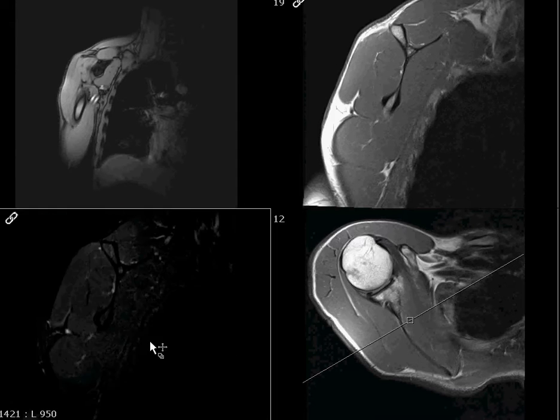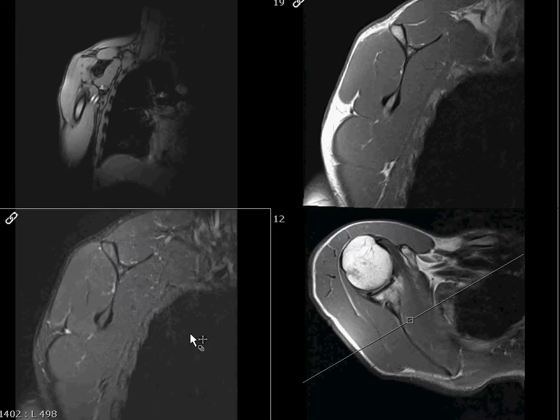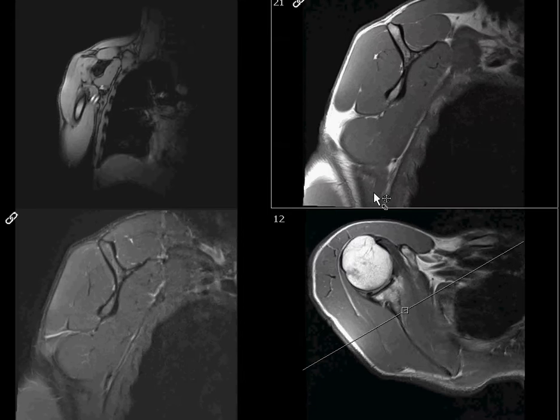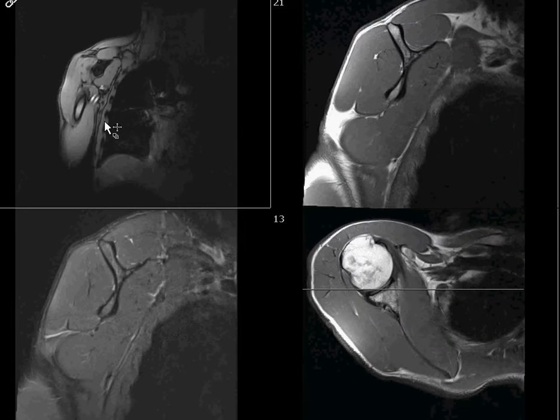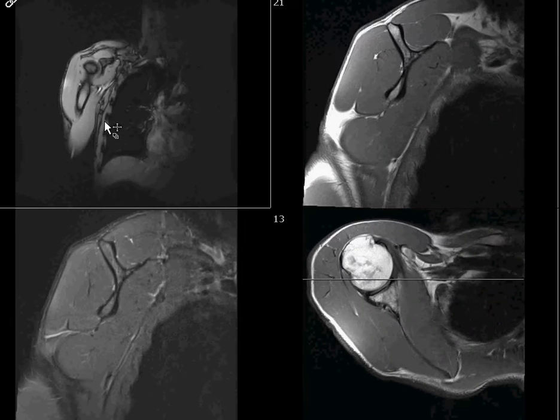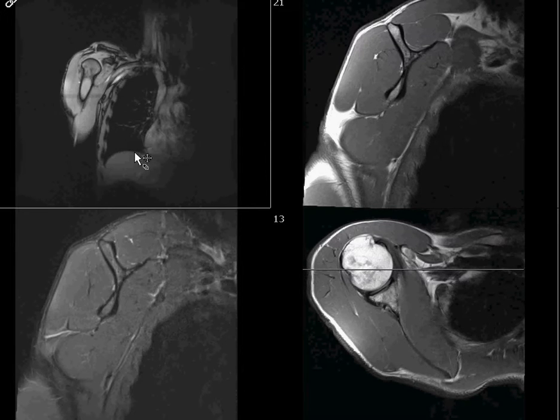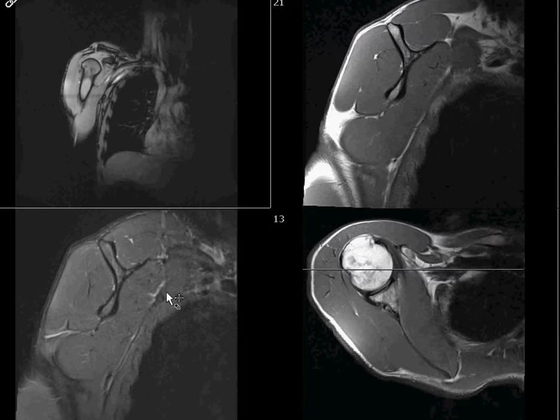This is an example of a normal scapular MRI. I just wanted to show the imaging planes here. So this is the scout images, obviously to kind of define the region. The scapula is larger than the field of view of the shoulder, so you're not going to be able to get the whole scapula on a routine shoulder coil.